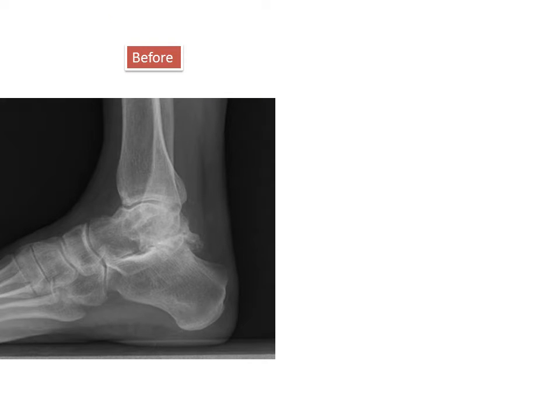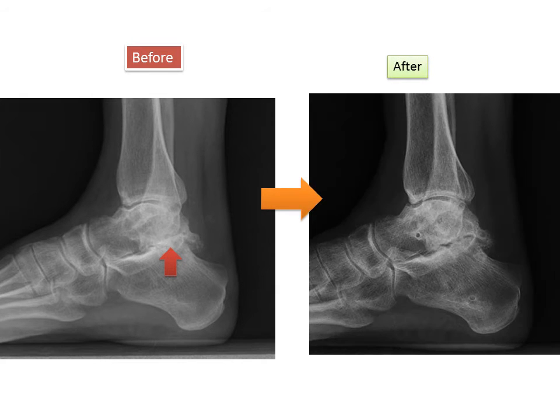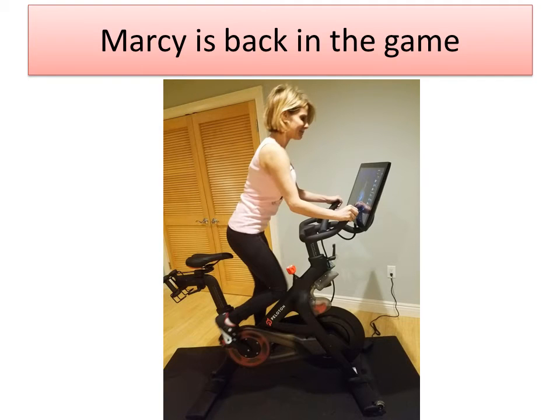This is a recap of what it looked like before, with severe arthritis, joint space narrowing, and subchondral density. And afterward, you'll notice a substantial improvement in the joint space with regenerative tissue and a normalization and improvement of the subchondral density. She's gotten back to her active lifestyle and is without pain.